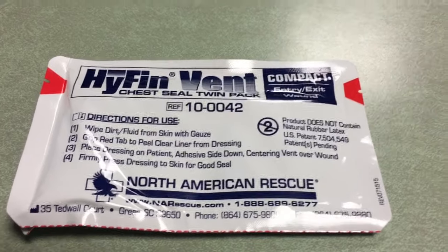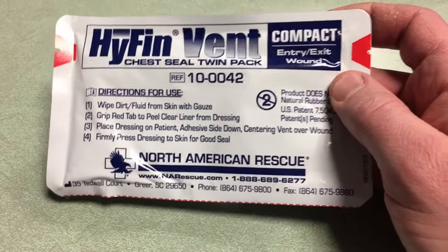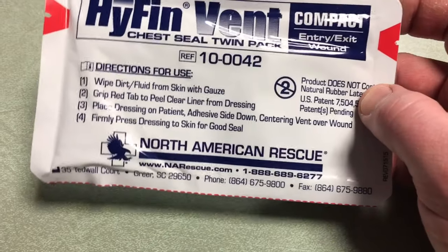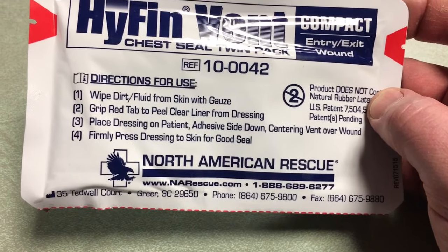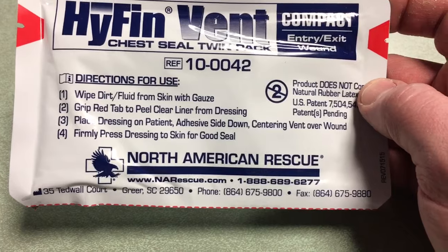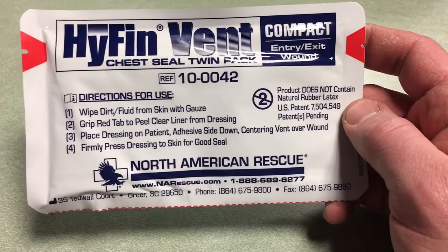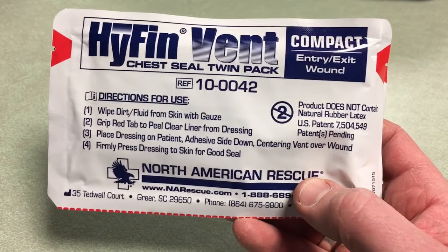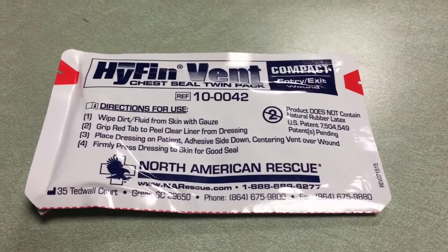This is a chest seal twin pack — it says compact entry/exit wound. Again, this is above my pay grade, but good to have in a worst-case scenario if someone gets shot and no one else is there to help. It does give some very basic instructions: wipe dirt and fluid from skin with gauze, grip the red tab to peel the clear liner from dressing, place dressing on patient adhesive side down, center vent over wound, press dressing to skin for a good seal. Sounds easy but in those situations, unless you're well trained, it won't go that smoothly.